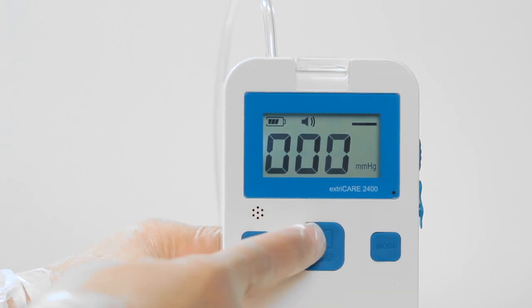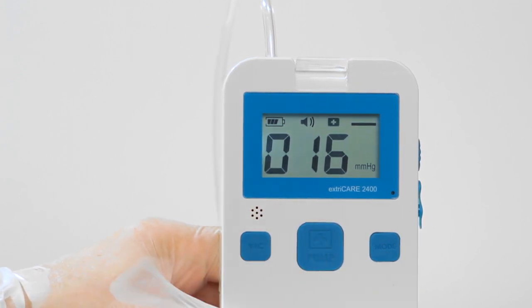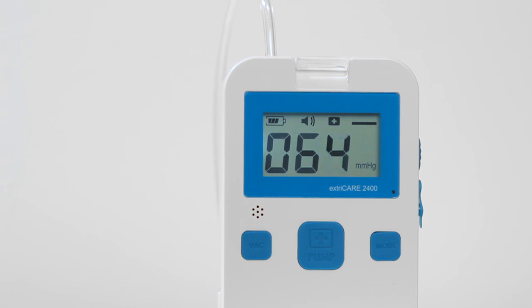To begin treatment, hold down the PUMP button until you hear a beep. You will hear the pump begin to operate. Once the correct pressure level is achieved, the device will begin treatment.